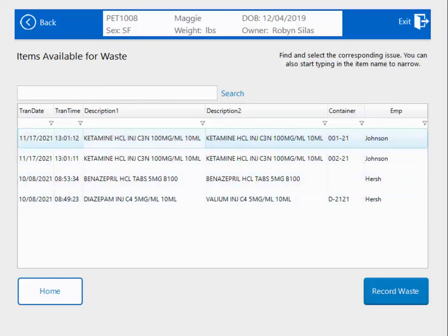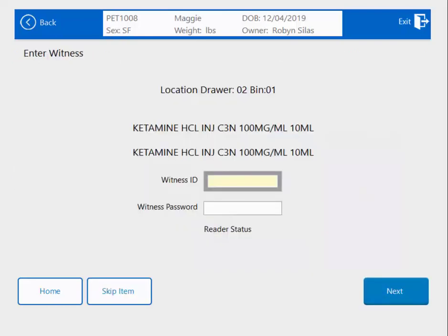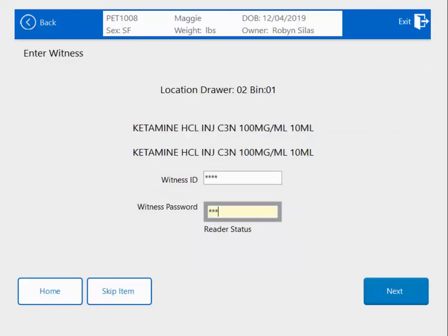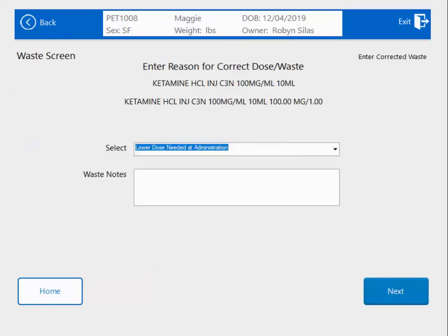Let's say I need to waste the ketamine, so I'm going to highlight that and hit Record Waste. Because ketamine is a controlled substance, I do have Witness turned on for all controlled substance transactions. And this brings me to my Record Waste screen.